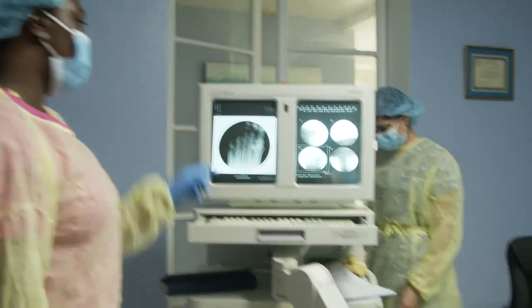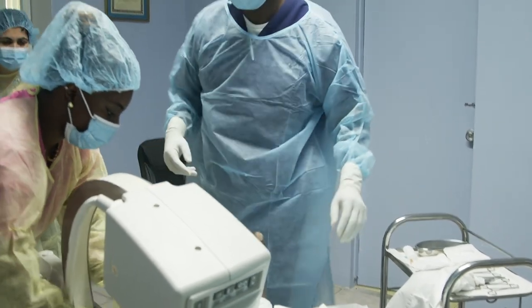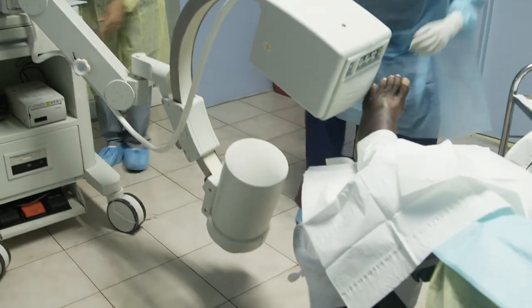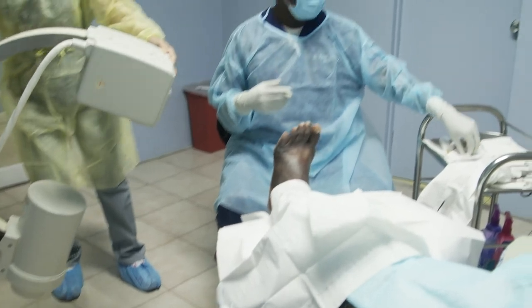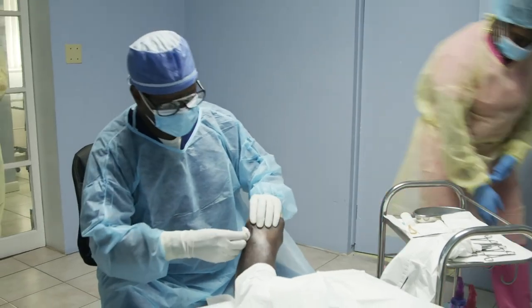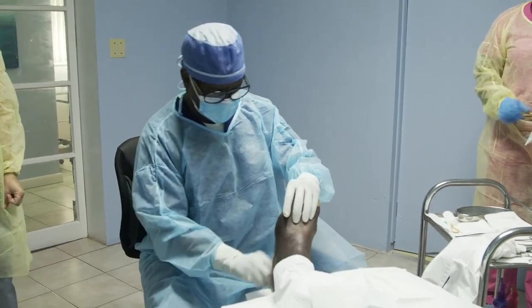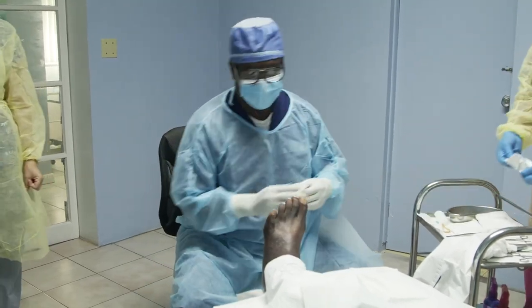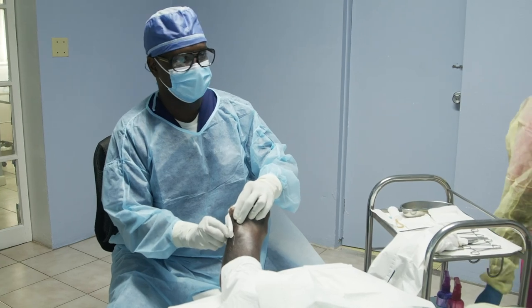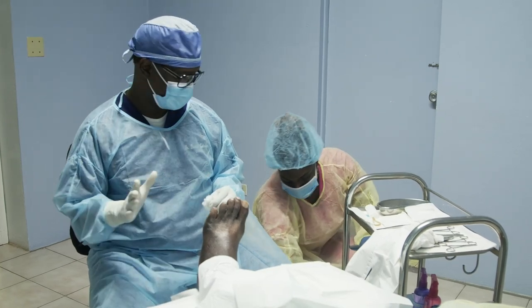Yay. Put your foot back up for me now. Right back up. Boom, right in the middle. Rest right down. You're good. And you'll slide that out. Okay. So having the advantage of a C-arm in office is great. So this is a decompression of that joint. Bone completely slid over. Everything fine underneath is beautiful. No problems whatsoever. Clean this up. One stitch, he heads home. In 2 weeks, this will be healed, completely healed. Okay, so this has been going on, this one wound here for 1 year, and now we're done with that.